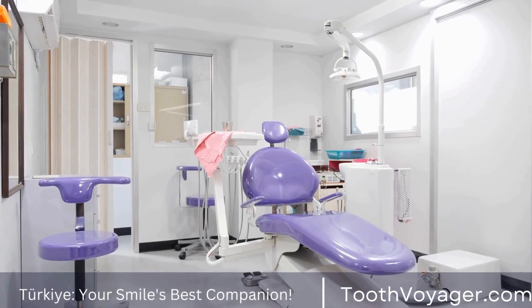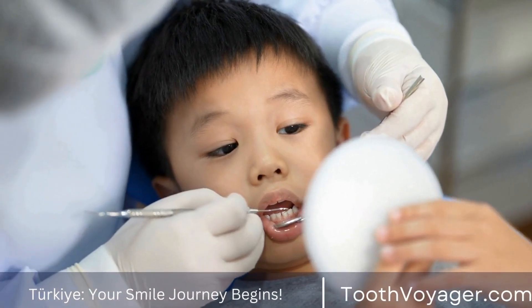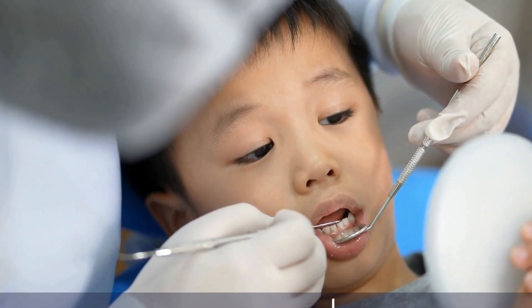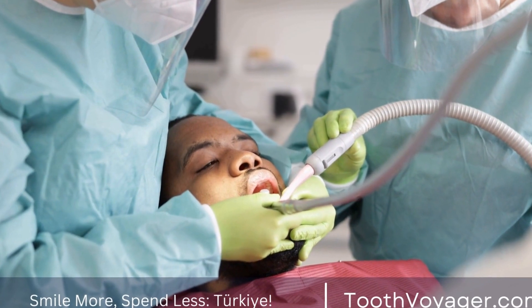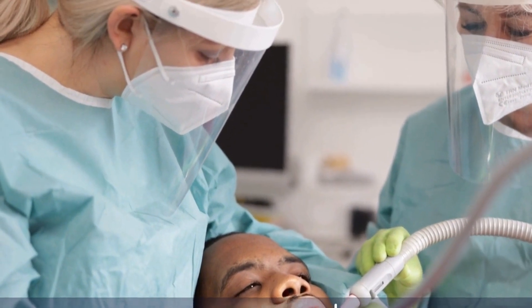In conclusion, obtaining a dental bridge is a straightforward process that can improve your smile and enhance your dental health. By following the steps outlined in this tutorial and working closely with your dentist, you'll be able to get an effective dental restoration that can last for a long time.